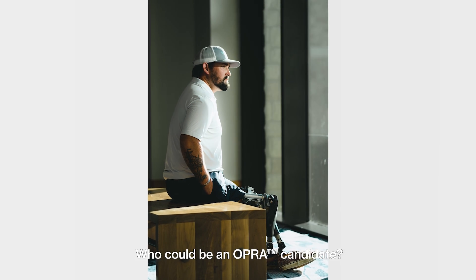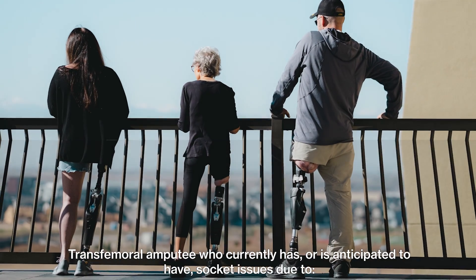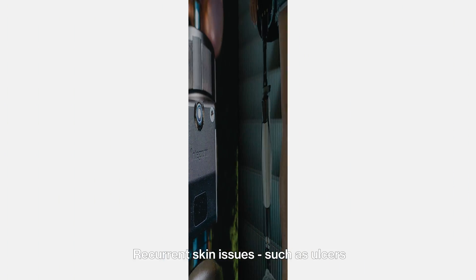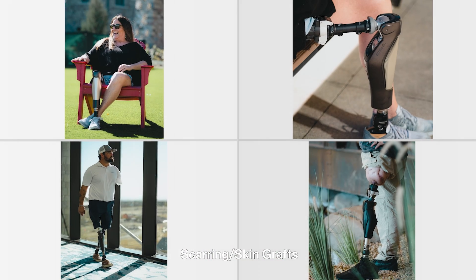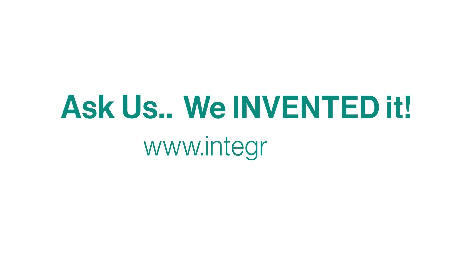Who could be an OPRA candidate? A transfemoral amputee who currently has, or is anticipated to have, socket issues due to recurrent skin issues such as ulcers, pain, short limb length, scarring or skin grafts, excessive sweating, or restricted mobility. Ask us — we invented it.